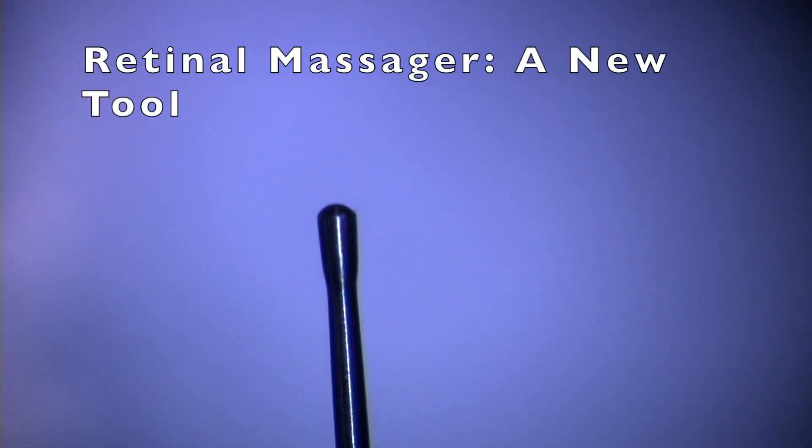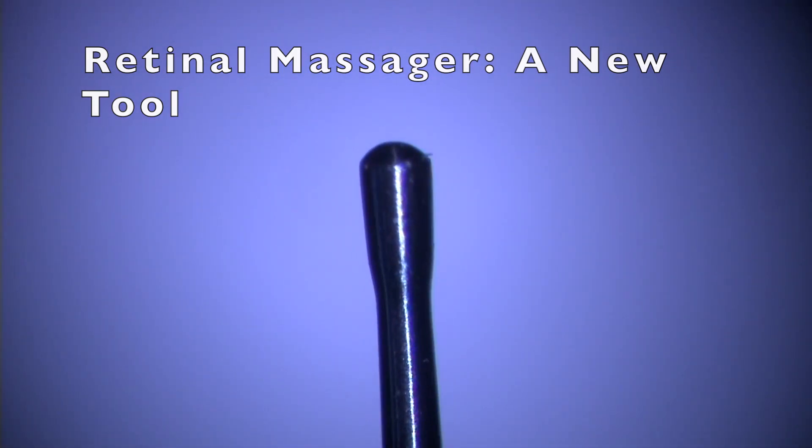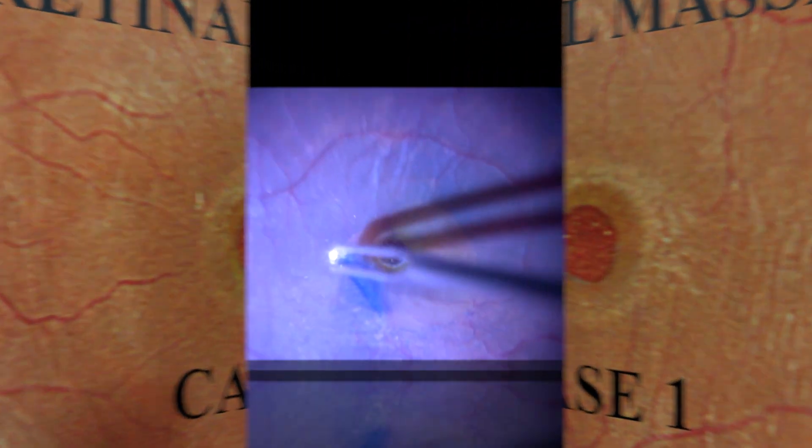To facilitate this massaging, we have developed a new tool called the retinal massager, which has a smooth bulbous tip that would be atraumatic on the surface of the retina. In this case, we demonstrate the use of this instrument.